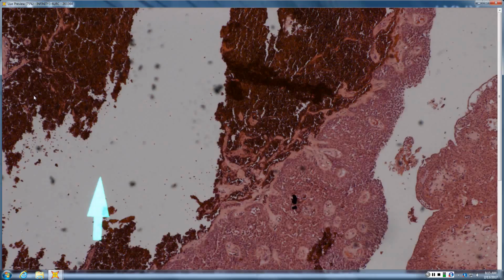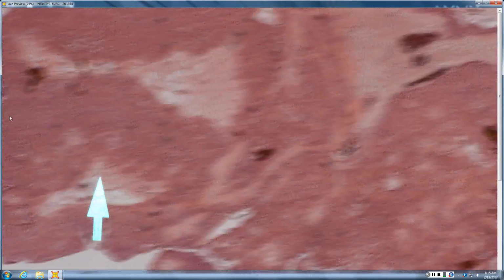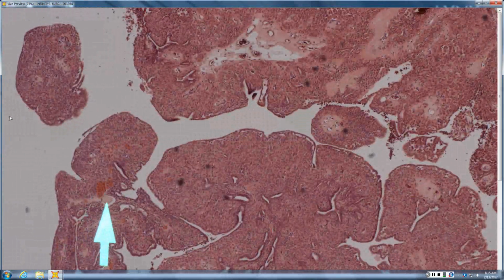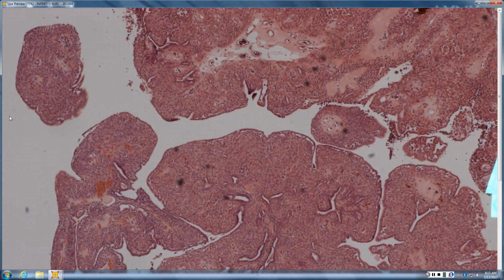You can see areas where it becomes cavitary, where it's filled with amorphous pink sweat, so it's a Schweddy tumor. And you have these areas of osteoid-like stroma with tiny little blood vessels embedded in them, so characteristic for the acrospiroma poroma group that it gets called poromatous stroma. So poromatous stroma looks almost like hunks of osteoid, but with tiny little blood vessels in it.